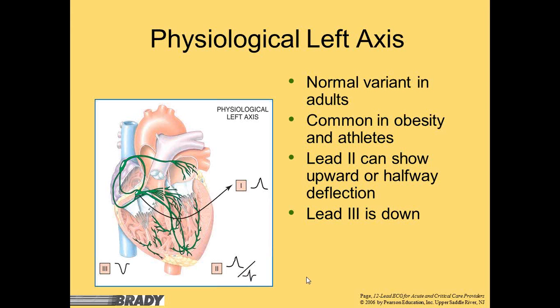If you have more positive, you're going to have a positive number. We're going to call that a positive deflection. If you have more negative boxes, then let's say we're going up 4 boxes and down 5. So when we subtract 5 from 4, we're going to have a negative 1. So that's a negative deflection. Okay, make sense?